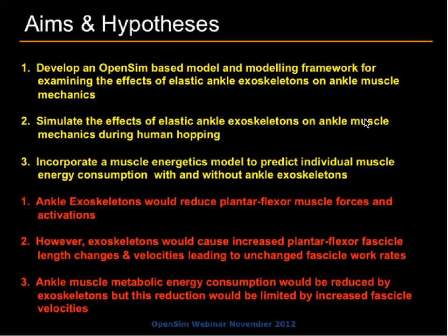We expected that we would reduce forces and activations in the plantarflexors by using an elastic ankle exoskeleton. But we would also see an effect of the exoskeletons of increasing length changes and velocities of the contractile elements of those muscles. And that this sort of negative effect on muscle mechanics would actually limit the reductions in metabolic cost that we were able to achieve in those muscles.